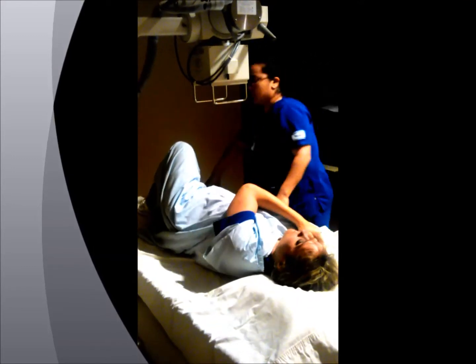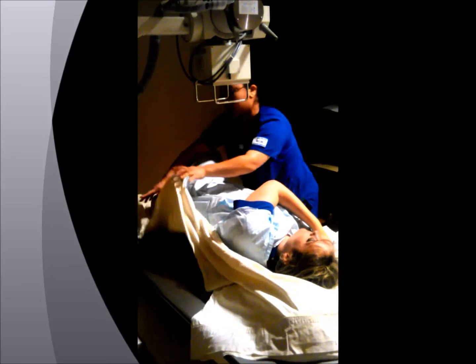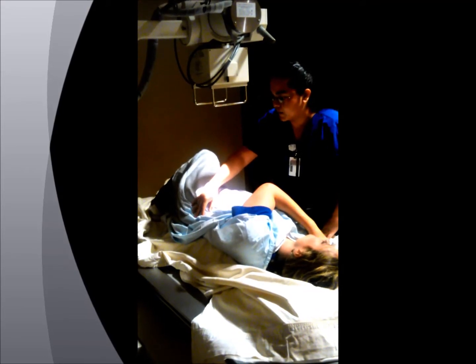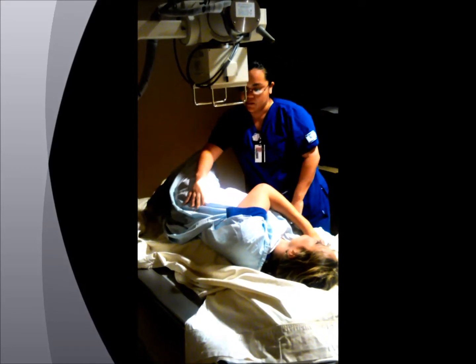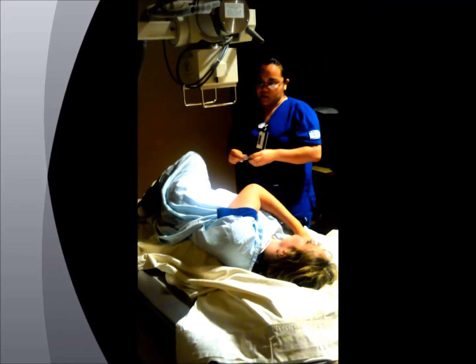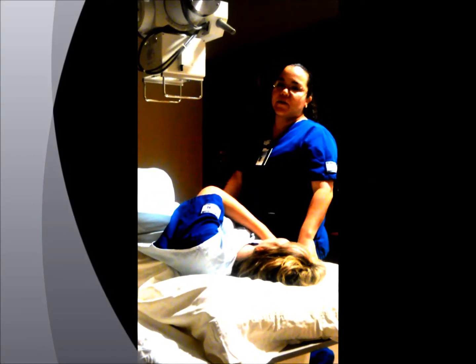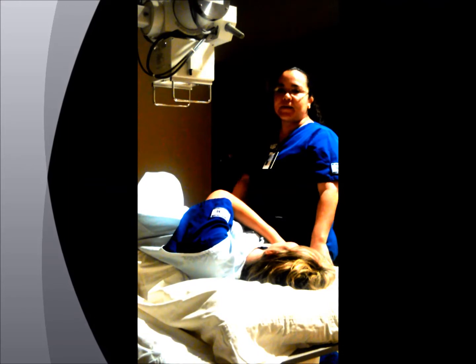Their arm across. Ensure equal rotation of the hips and the shoulder. Again, you just want to feel for the crest to make sure you're 2 inches above and 2 inches medial of the ASIS. Collimate in again, and this time you change your marker to the right side down and expose on expiration. With this projection, the zygapophyseal joints and Scotty dogs should be visualized, and you want to use an 85 to 95 kV range.